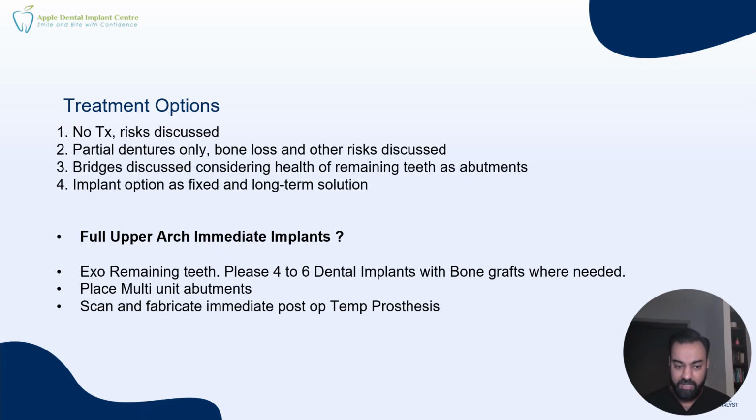We have designed it. The only factor that changes is that we will align it to where the implants end up. That will require some changes and modifications to the design, but it also saves our post-operative time for design requirements. So we will design, finalize that, print the temporary prosthetic in office, which you will have an opportunity to see, cure it, finish it, and install it on the same day.